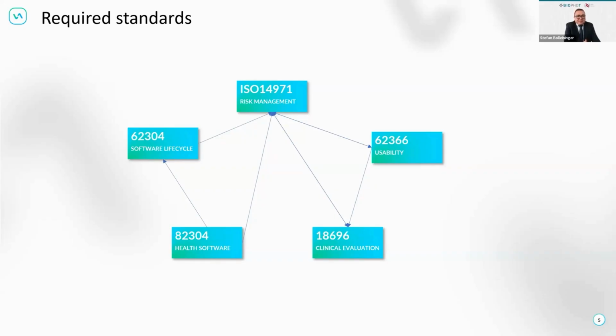It can be a medical fitness system. Every firmware falling for medical devices is in that standard. In addition, also all software as a medical device, an application, a web application, a native app, iPhone, Android, you name it, they are also falling under the 62304 standard.